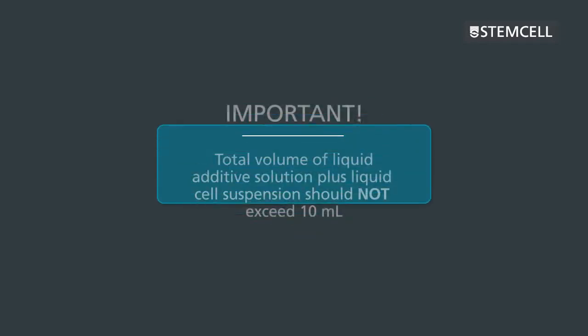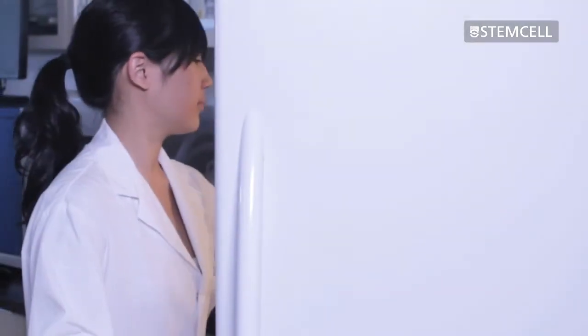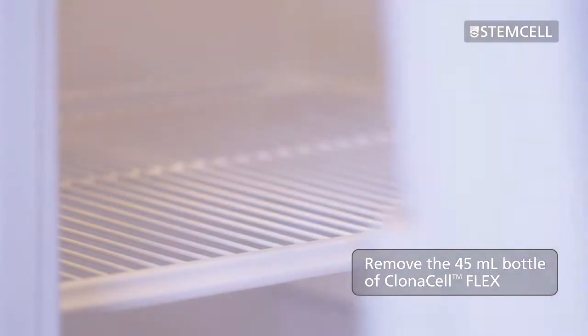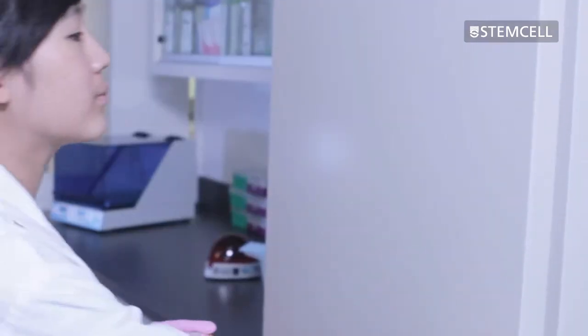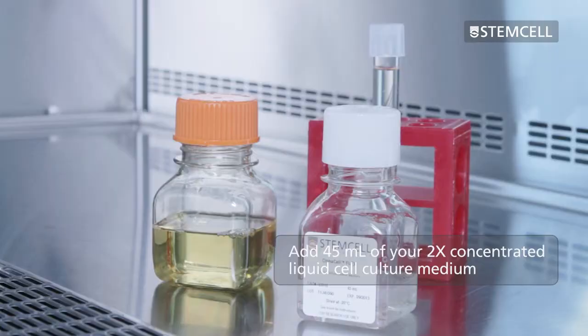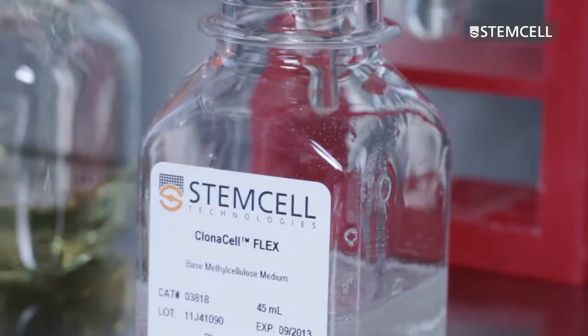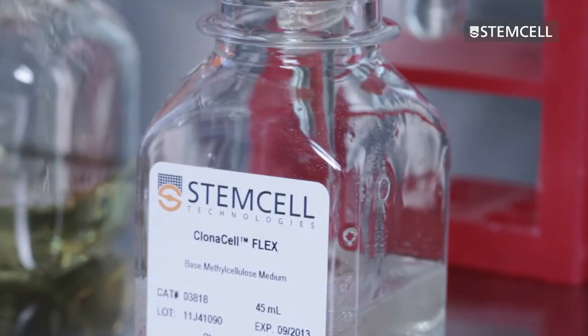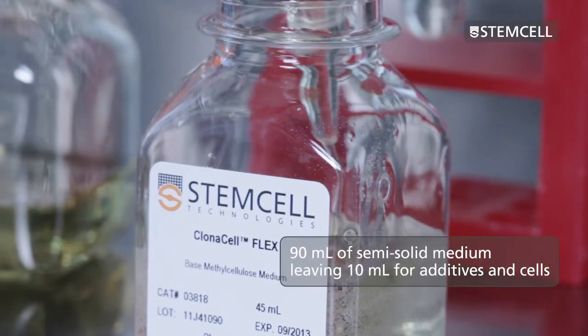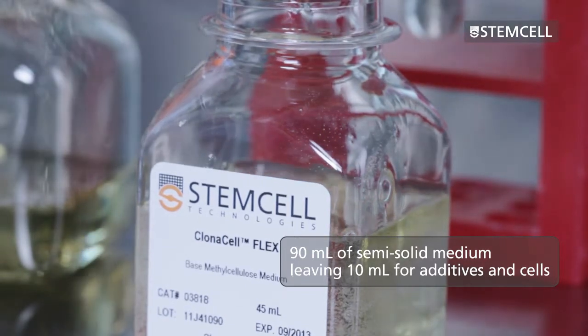It's important to remember that the total volume of the liquid additive solution plus the liquid cell suspension should not exceed 10 milliliters. To prepare the semi-solid medium, first remove the 45-milliliter bottle of ClonaCell Flex semi-solid base medium from the refrigerator. Place the bottle in an incubator at 37 degrees Celsius to pre-warm the medium. Add 45 milliliters of your 2x concentrated liquid cell culture medium. This medium should be specific to the cell type and selection system you are using. Your bottle should now contain 90 milliliters of semi-solid medium, leaving a total volume of 10 milliliters for the additives and cells to be added.